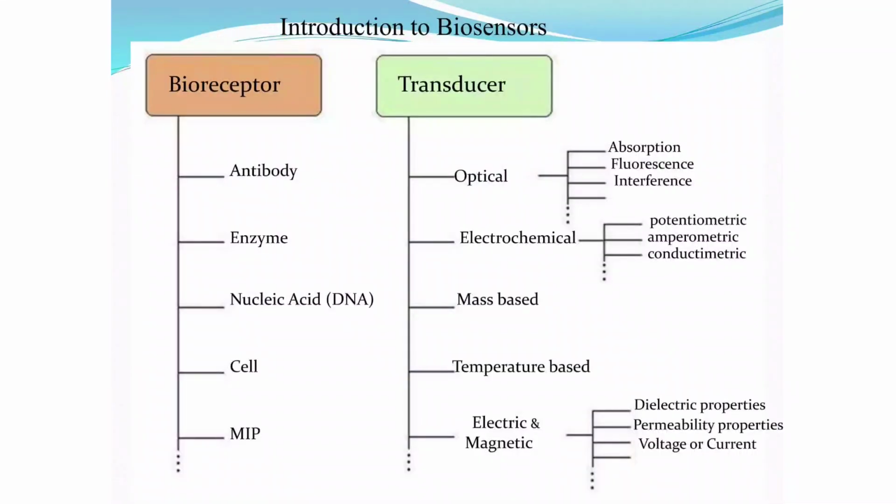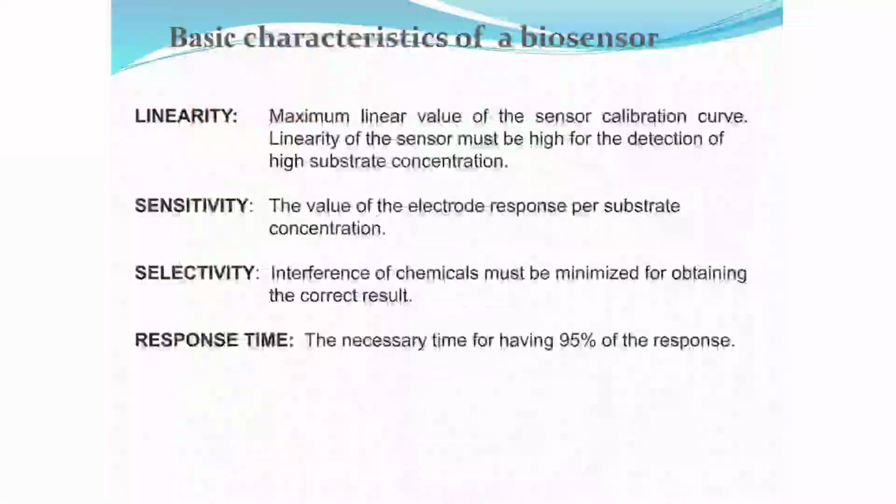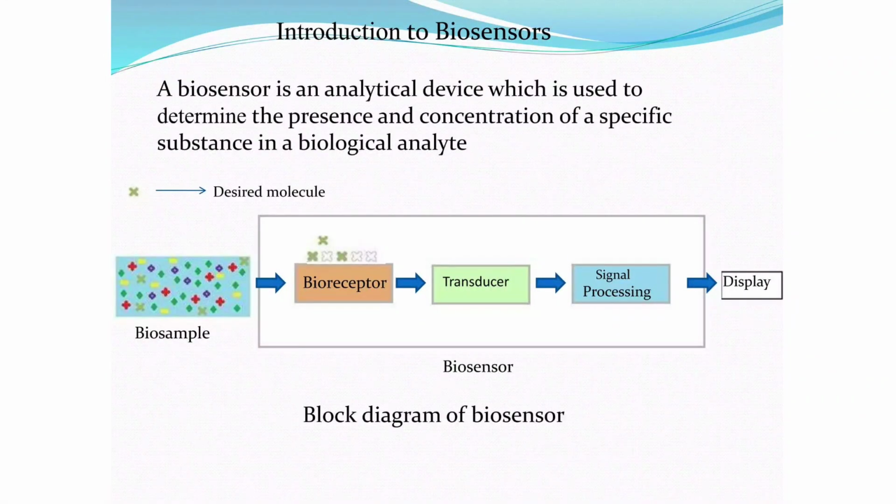So here, the operational chemistry of a standard glucose biosensor is based on glucose oxidase, which we commonly call GOx. This enzyme catalyzes the oxidation of beta-glucose into gluconic acid, that is, glucose plus oxygen gives gluconic acid plus H2O2, that is, hydrogen peroxide.